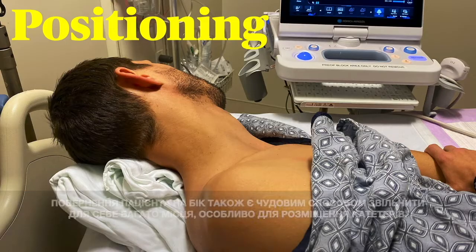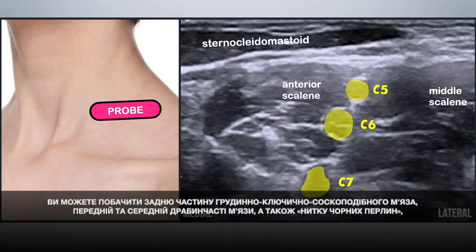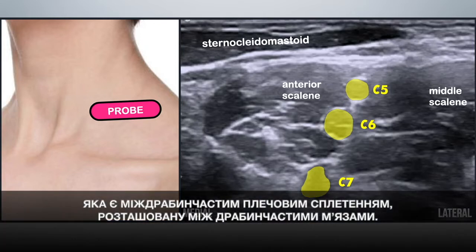Placing an ultrasound transducer on the anterolateral neck one to two centimeters north of the clavicle should get you an image like this. You can see the posterior aspect of the sternocleidomastoid muscle, the anterior and middle scalene muscles, and the string of black pearls that is the interscalene brachial plexus nestled between the scalenes.